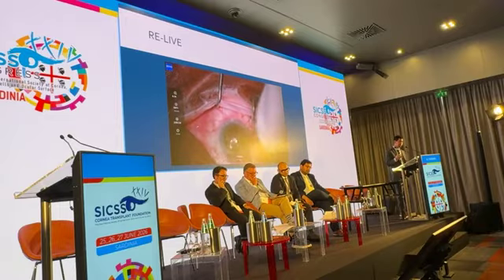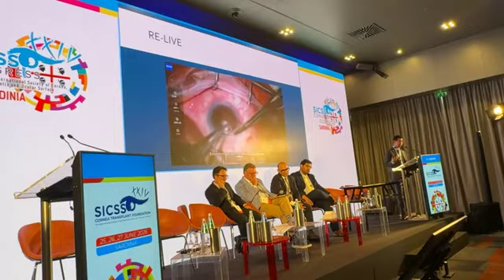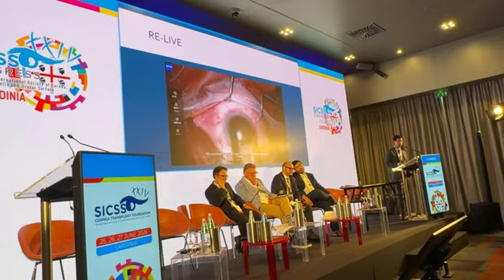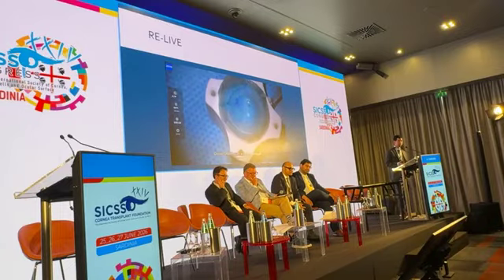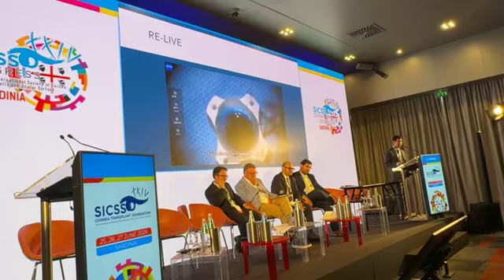and then you're going to remove the involved pathology as well. There's a fibroblastic pannus that's often associated with limbal stem cell deficiency, so here I'm just removing that with a pair of scissors and peeling that as well. And then doing quick measurements with the calipers. Here's the tissue as it comes pre-stripped.